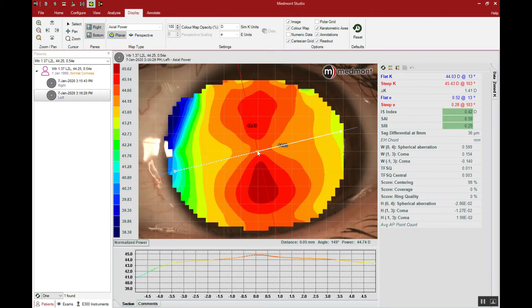Here we have another case. Let's go to display and select the axial power interpretation so we can understand the central corneal astigmatism. Here we can see an obvious indication of the orientation and type of corneal astigmatism presented. We notice a very regular presentation — one hemisphere is pretty much a mirror of the other. But this astigmatism appears to spread from one side of the eye to the other. This is what you call limbus-to-limbus corneal astigmatism, which is more challenging simply because the ortho-K effect has a harder time pushing that steep curvature out of the central cornea.